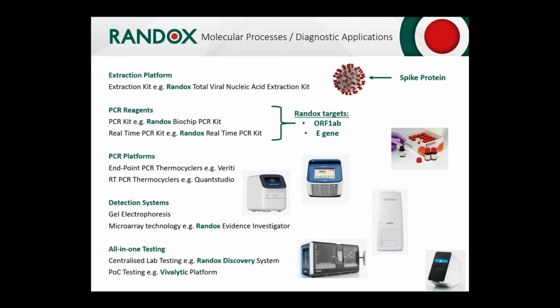So there's a whole host of different technologies and systems that can be incorporated within a molecular lab workflow, but what they will all have in common is that they follow a traditional molecular one-way unilateral flow work layout. It's great you had so many different options at your disposal whenever you were carrying out the tests within the lab, so you weren't just confined to one method of testing essentially.